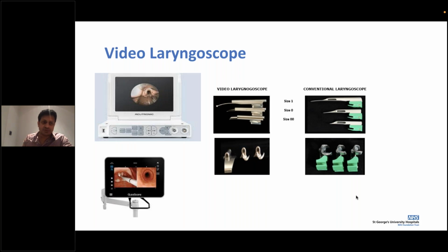The technique between video laryngoscope and traditional intubation is ever so slightly different. Now, how is it different? Video laryngoscope and conventional have different views, as put on the slide. If you look at not the top two photographs, but the one below, the video laryngoscope may well obstruct your view. So the aim of video laryngoscope is a different technique.